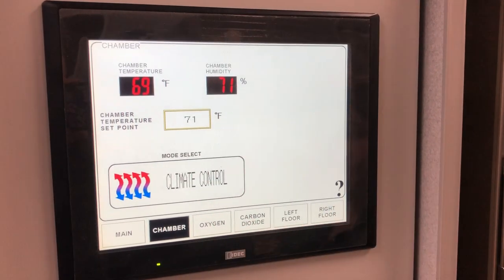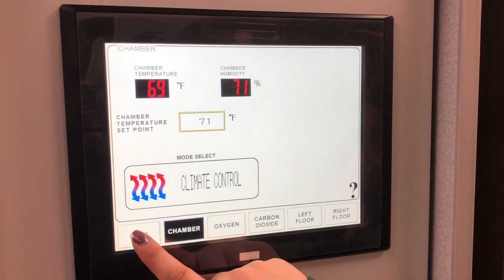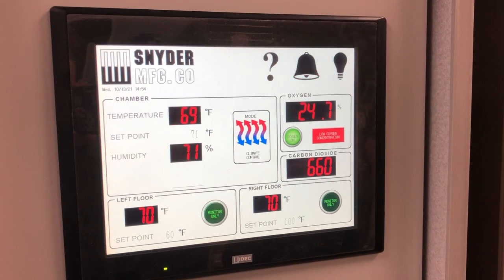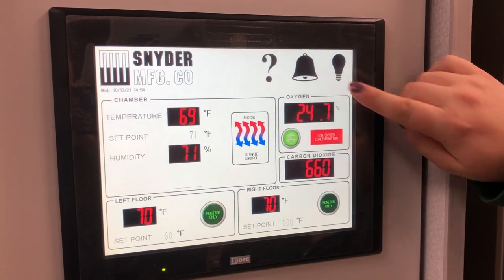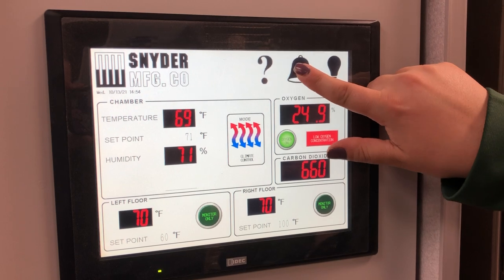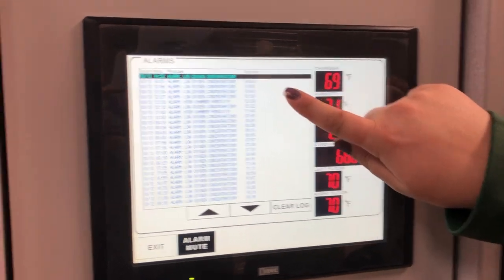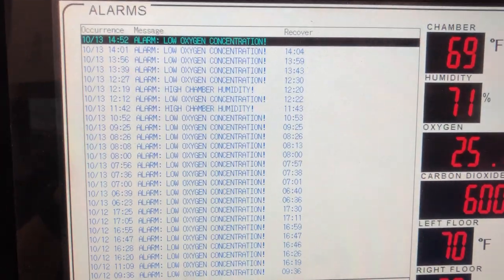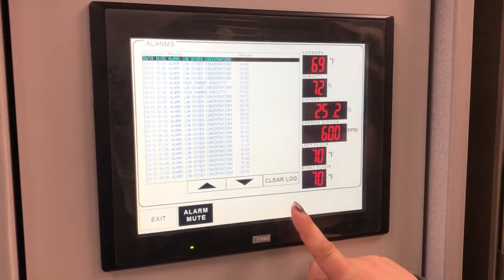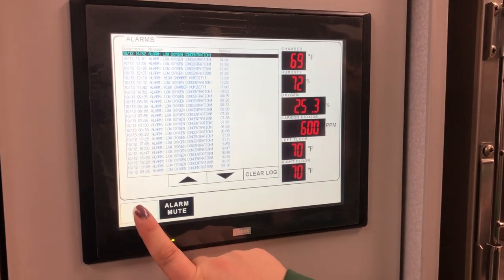Select climate control so that it maintains the set temperature, then go back. The alarm is going off because the oxygen is not yet at the set level. If you click on it, you can see all of the different alarms that have previously gone off. You can mute the alarm, clear the log, and exit.